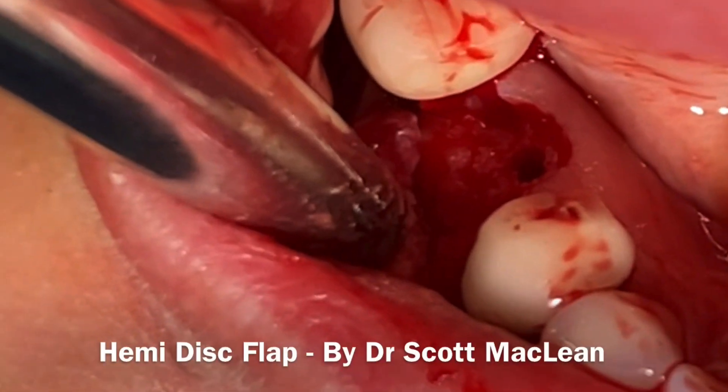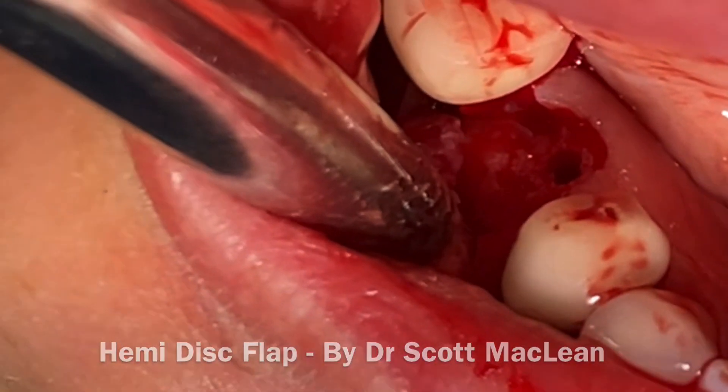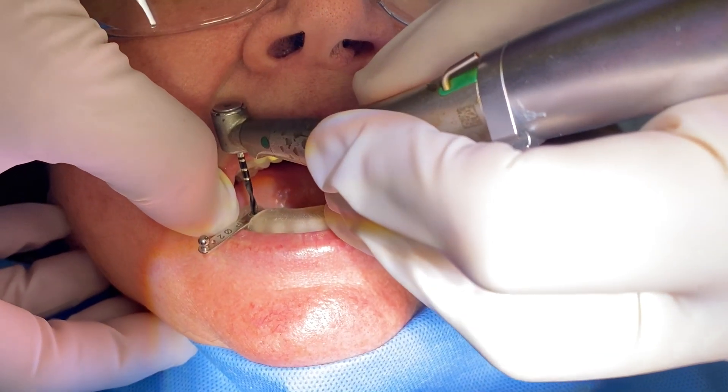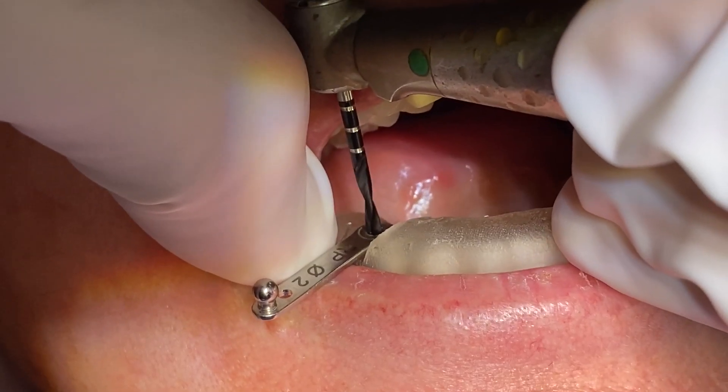Hi, it's Dr. Scott McLean and this is a presentation about the Hemi Disc Flap. I'm sure someone else did this before, but this is something I also came up with.